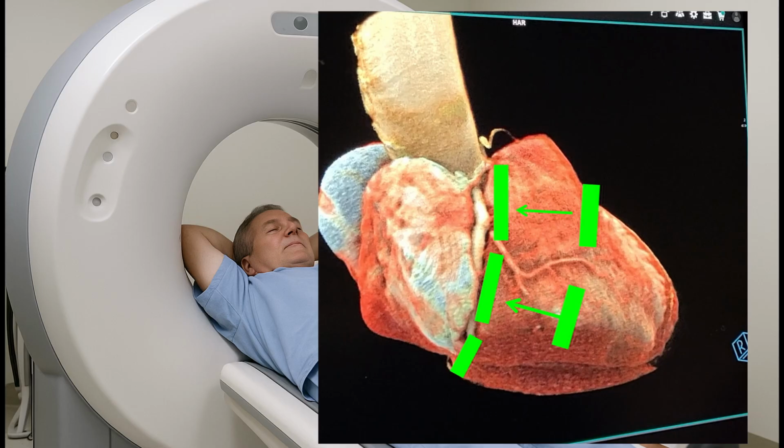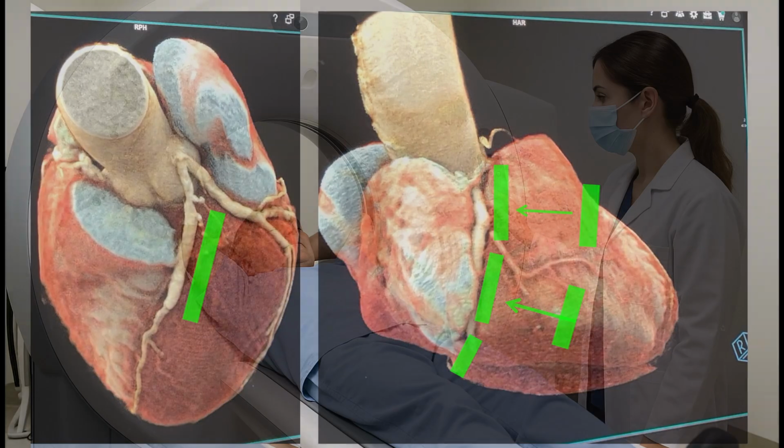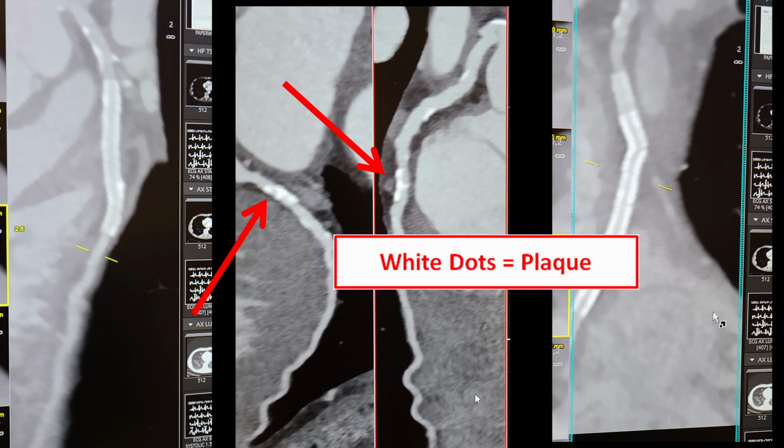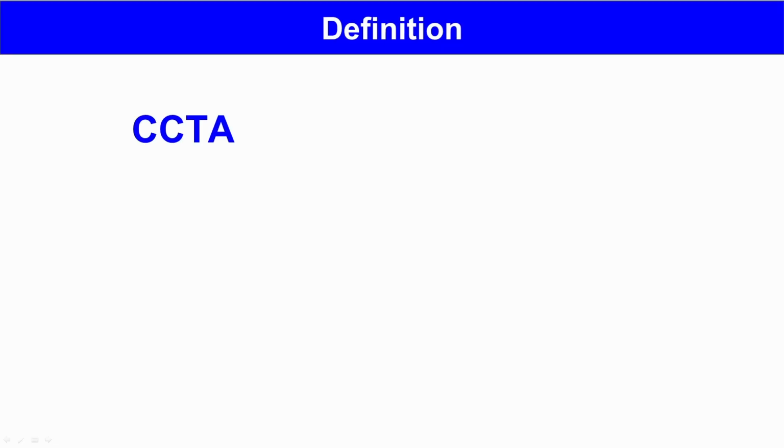And I could definitely feel it for a few weeks after the surgery. If you're counting, that's 6 stents total, 3 in the RCA, plus another 2 placed inside of those, plus 1 in the LAD, or widowmaker. The radiologist can also zoom in on individual arteries and look for hard and soft plaque, blockages, and blood flow. As you see in this image of one of my stents, they can even see inside the stents. We refer to these as CCTAs.